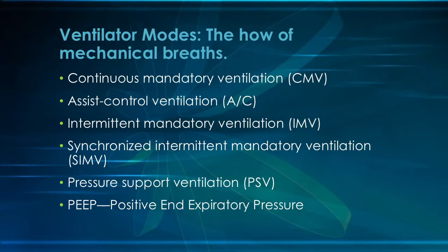The population that you're going to see this most with is definitely during surgery. With general anesthesia, you're going to be under continuous mandatory ventilation. Assist control is kind of like CMV, but you can allow the patient to start breathing over it. So it's kind of like a step down.